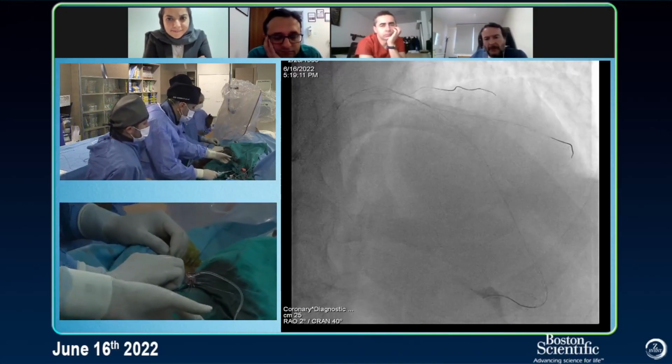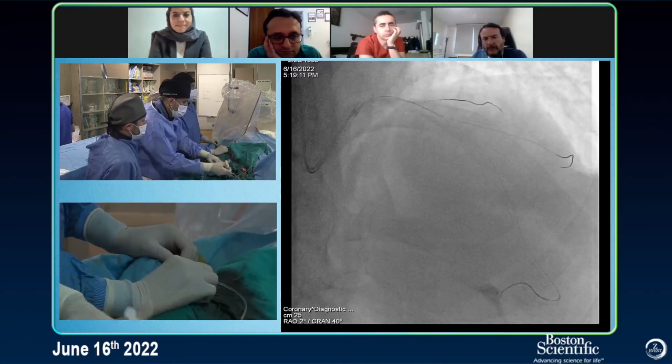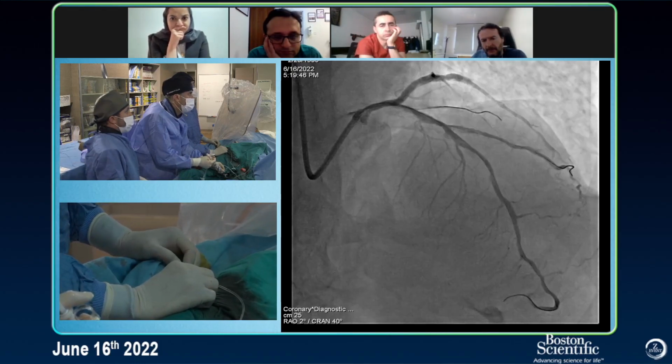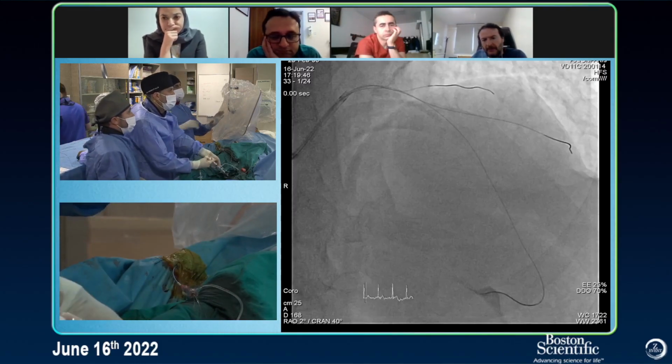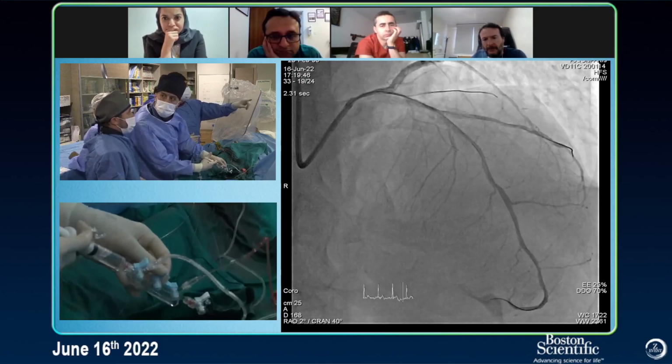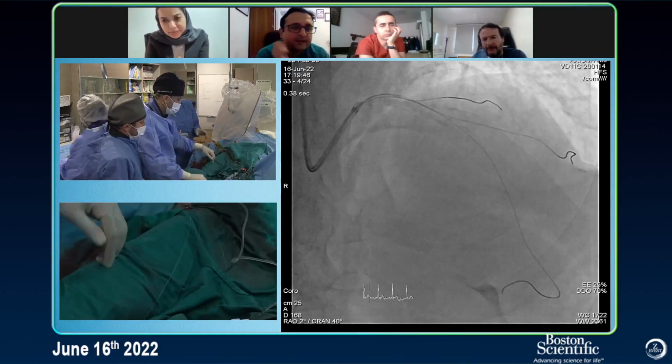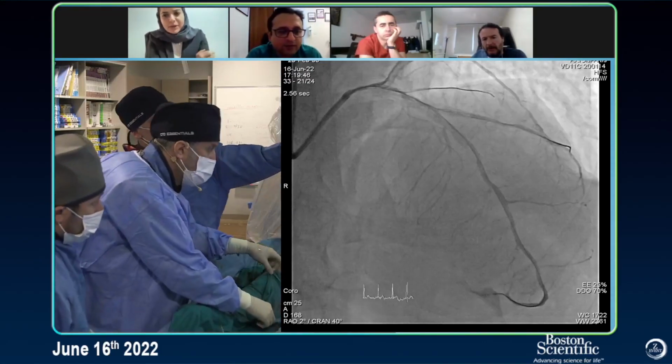Let's see again. Can I have some nitro, guys? Yes. Pressure is okay. Everything is okay. We have dissection for sure. So tell me 2.75 or... I think 2.5 is good. Then I will extend it 2.75 anyway. How long, 38 or something?